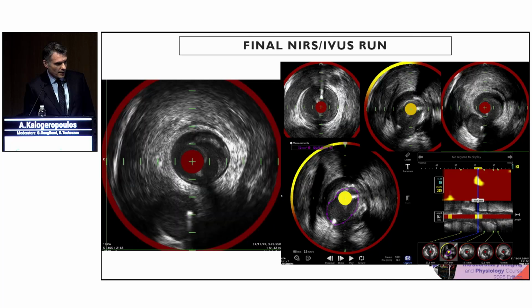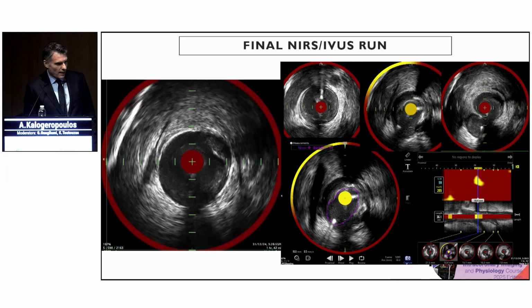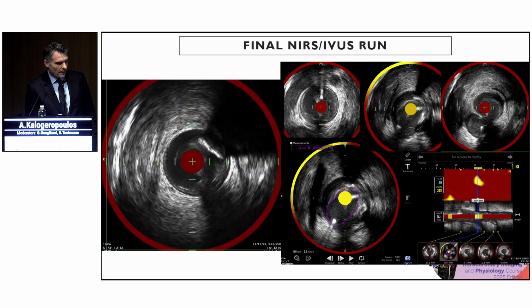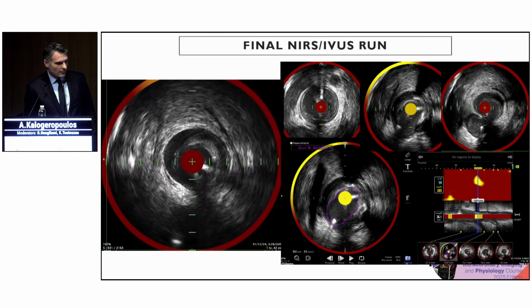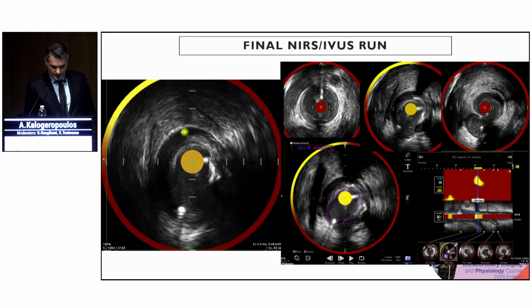We used the intravascular imaging again, and here's the run of IVUS. On the right side, we can appreciate some still images, and we can see the luminal area is massively improved. On the bottom picture is the first diagonal branch lesion. You can see now we achieved around 7 millimeters squared minimal luminal area. We can appreciate the actual medial dissections here.